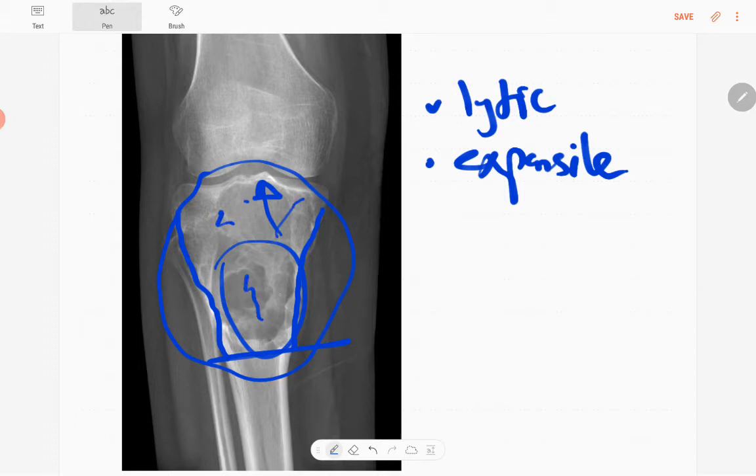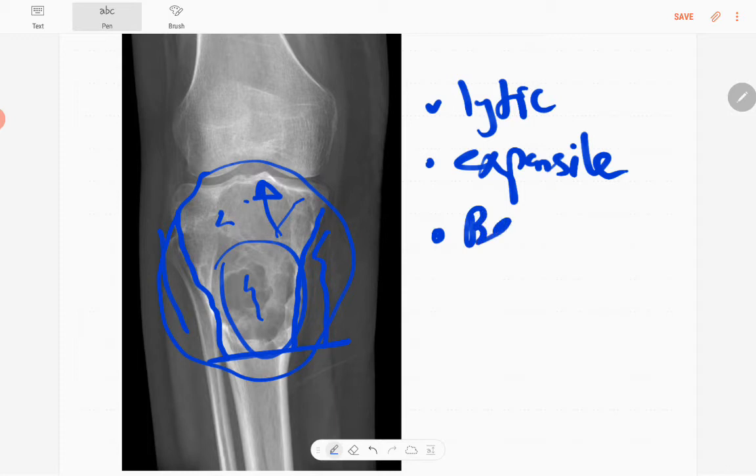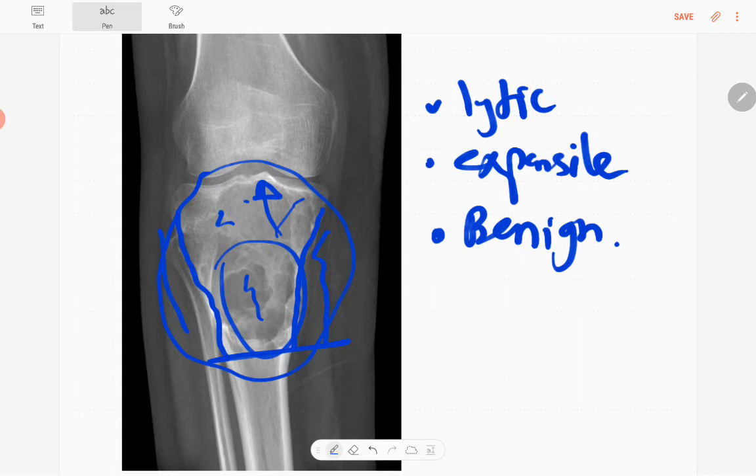There is no definite sclerosis or calcifications, no soft tissue component, and no periosteal reaction, so it's a benign lesion. Other features include no synchronous lesions.